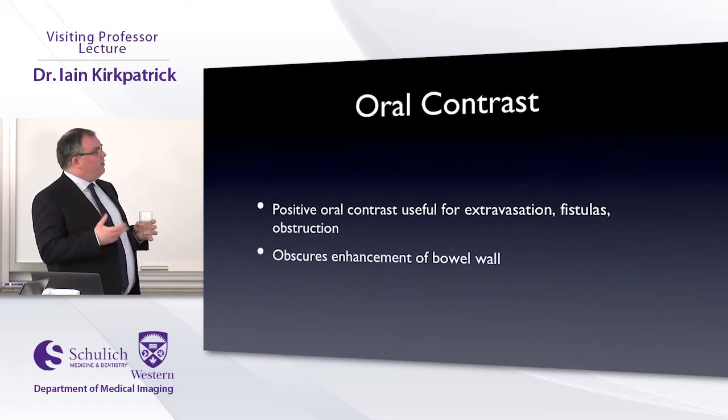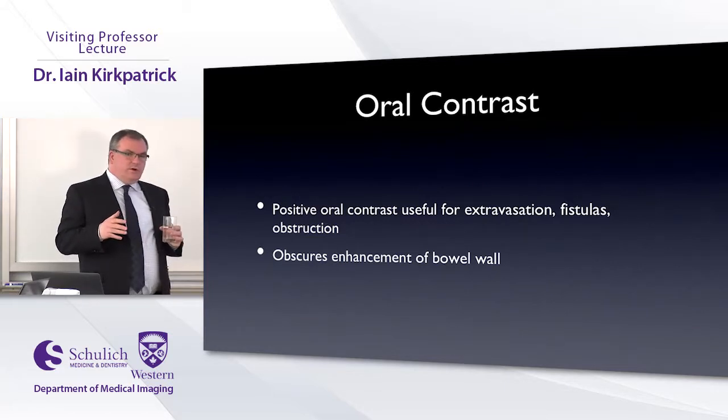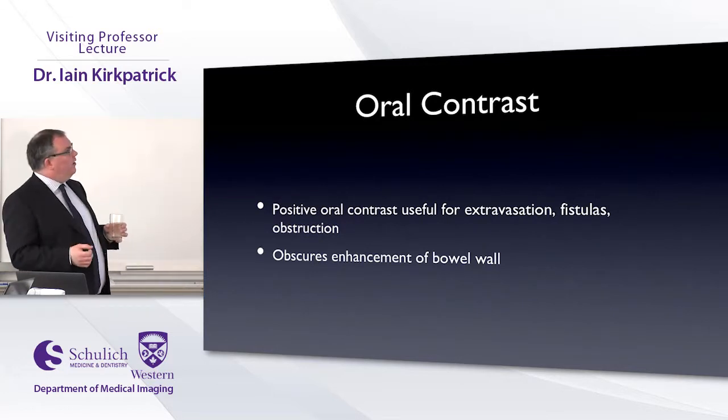We'll still give it for extravasation, like post-op, perioperative patients. If you're looking for fistulas, or in cases where there's maybe a low-grade partial obstruction and the surgeon's wondering, will the oral contrast go beyond the transition point, because then I'll treat them conservatively for a little while longer.